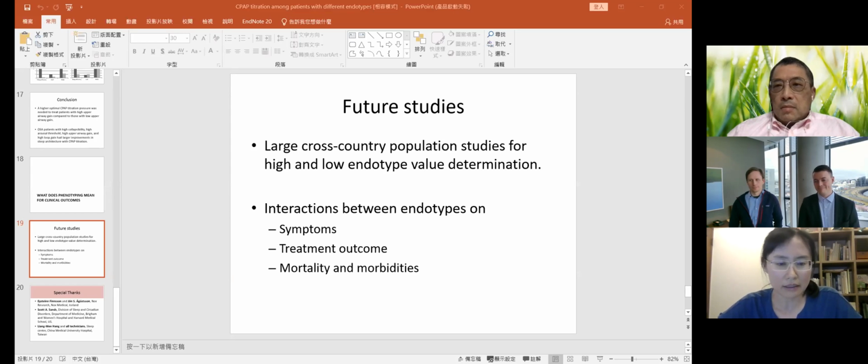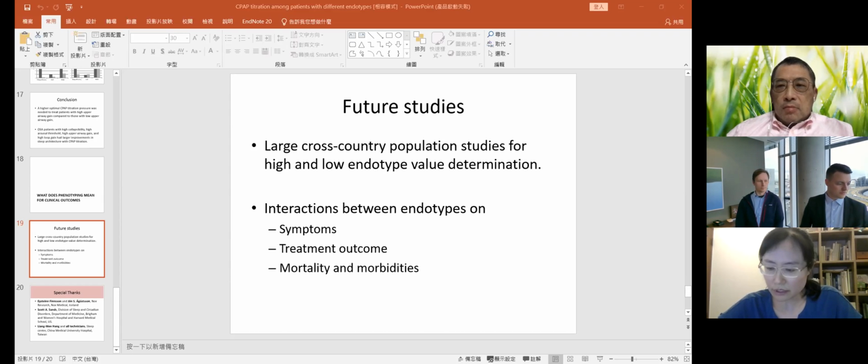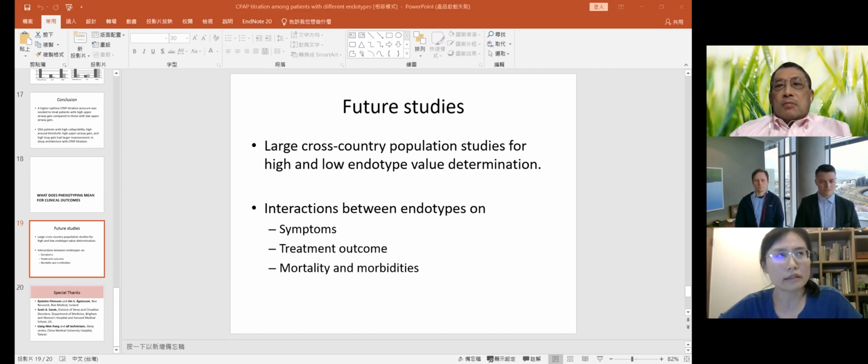Well, yes, before we can do the endophenotyping using the PUP method, one method by Dr. Edwards and his team has tried to use the hypopnea fraction, the nadir oxygen saturation, and AHI, these three variables, to estimate arousal threshold.